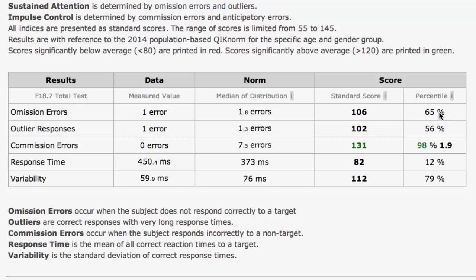Let me spend just a moment on percentile because we can see some interesting numbers here. Those of you who used the old norm may recall we would get standard scores of zero and percentile of zero or one. The issue was that comparison with the old norm — in some age brackets it would literally just have a few people, and those few people would have no mistakes, no omission errors at all. So if somebody made one omission error, that would be hugely punished by the database. Now, with such a larger dataset, we can really compare that and see more at every age group — here's one error, here's where you lie.